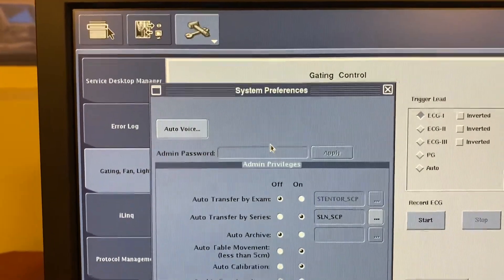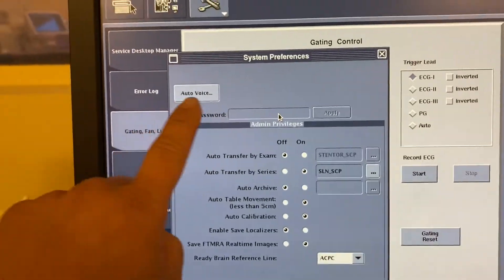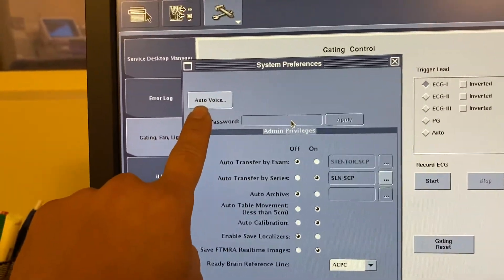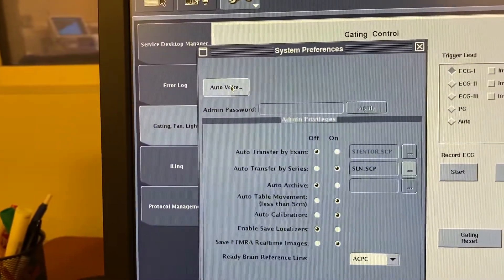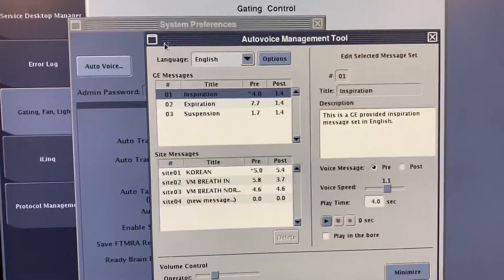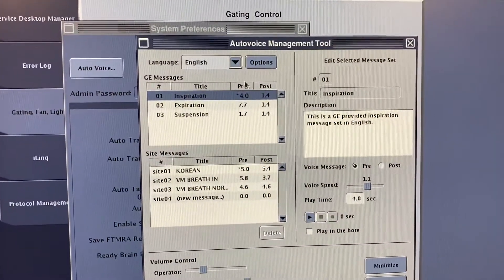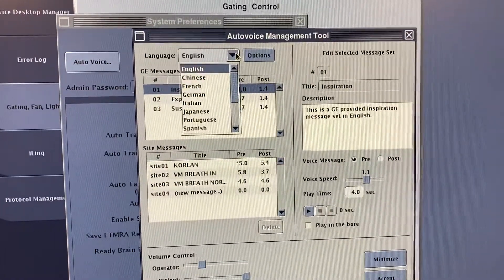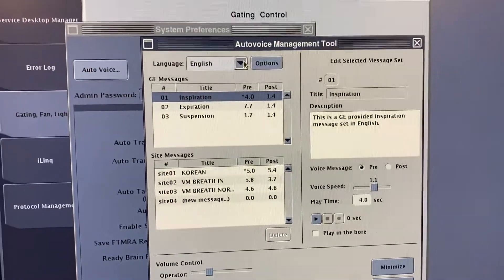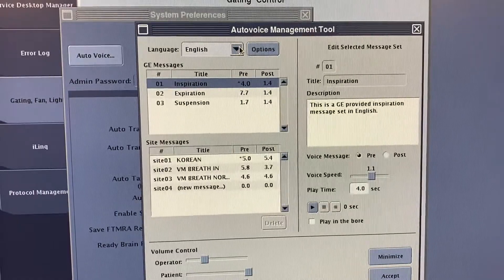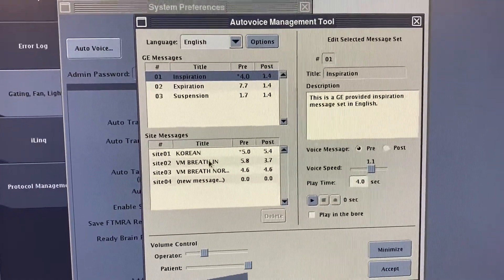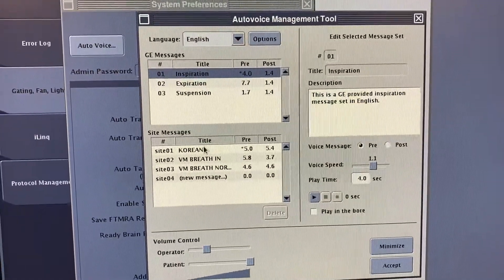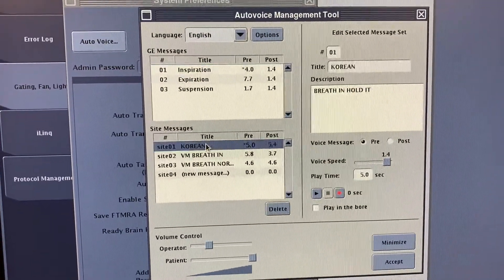Then here, the first thing you do is pick Auto Voice. Within Auto Voice, you have all these languages here. What you want to do is go down to here and click on one of these things.